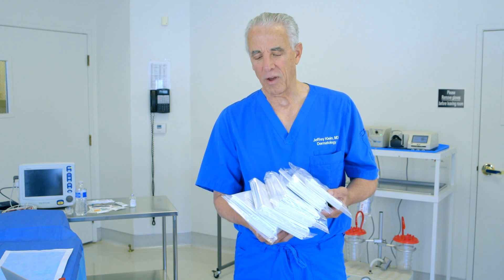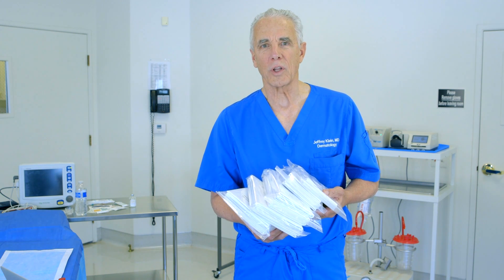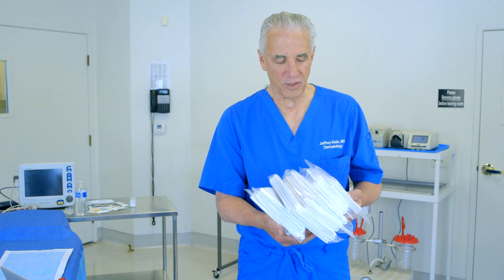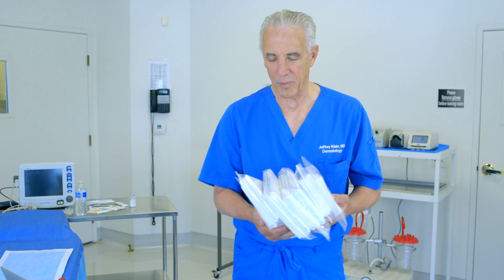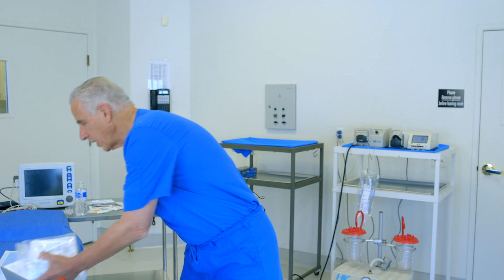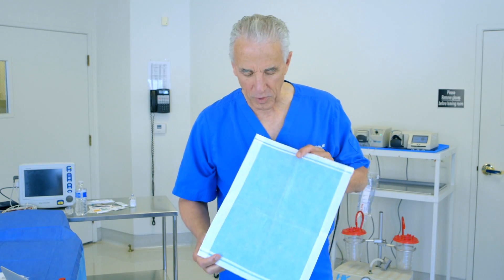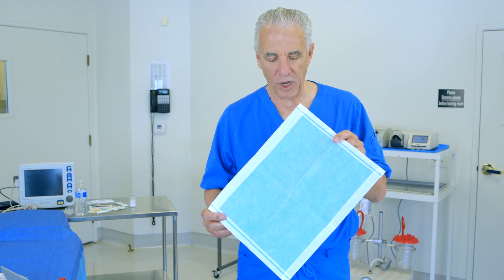These are examples of superabsorbent pads that are used for post-liposuction care after tumescent liposuction. They come in various sizes from extra small to extra large. This is an example of a medium superabsorbent pad produced by HK Surgical.